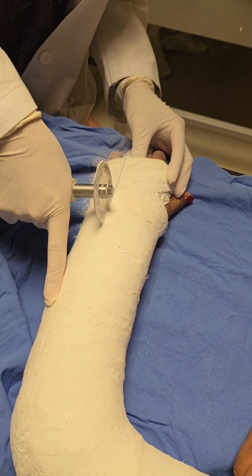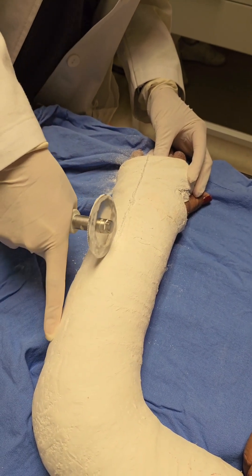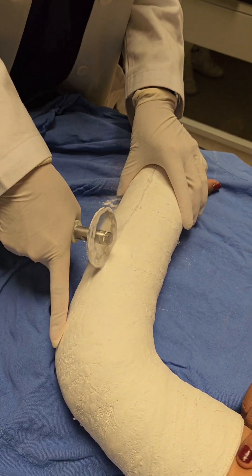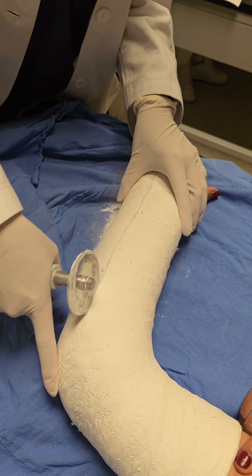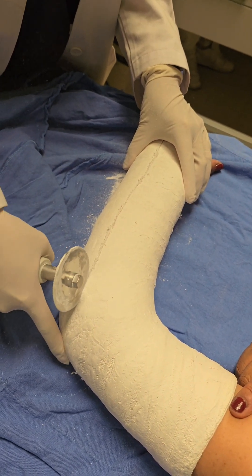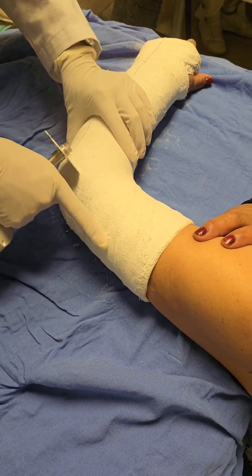The importance of cast removal. So why is removing a cast such a big deal? After weeks of healing inside a protective cast, your wrist has likely mended, but the cast needs to come off in the right way to avoid any potential complications. The cast saw, a key tool in this process, is specially designed to cut through the hard shell of the cast without harming your skin. When done correctly, this step is not only safe, but also vital for allowing your wrist to begin the next phase of recovery: regaining strength and mobility.